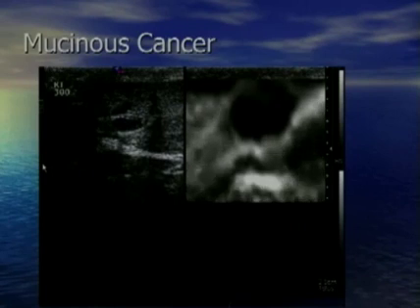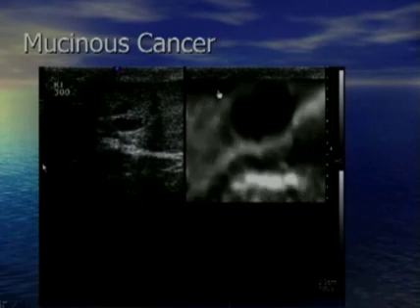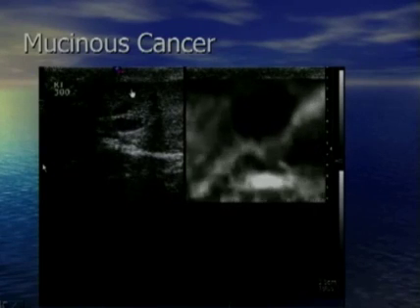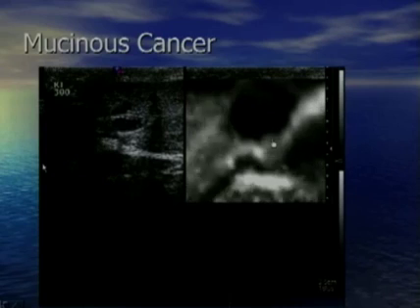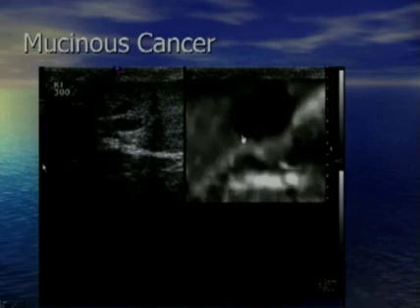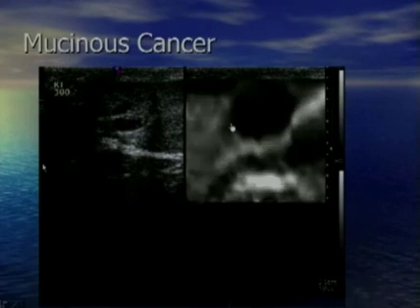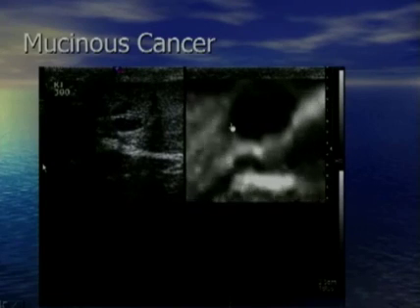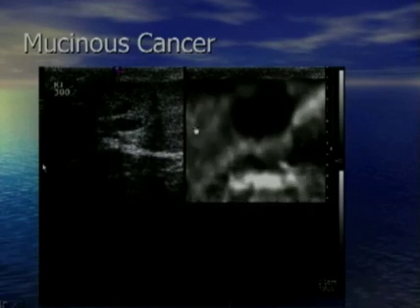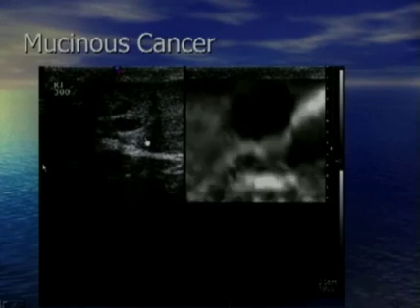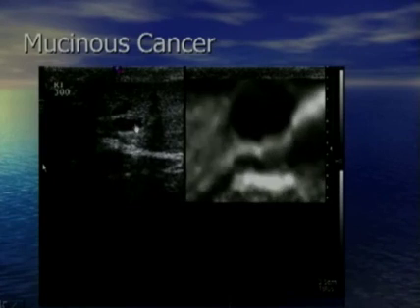This is a video clip of a mucinous cancer. On B-mode the lesion is somewhat isodense to the surrounding tissue with some hypoechoic areas, but on the elastogram the borders are quite well visible throughout the cycle. What we've found with mucinous cancers is that the ratio is one or slightly larger, so we don't see the dramatic size changes that we see with invasive ductal cancers.